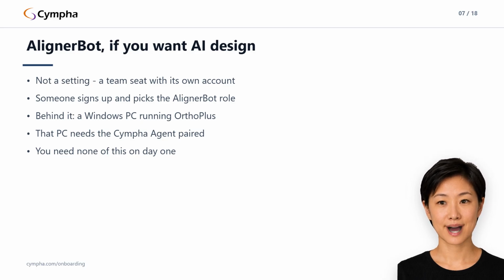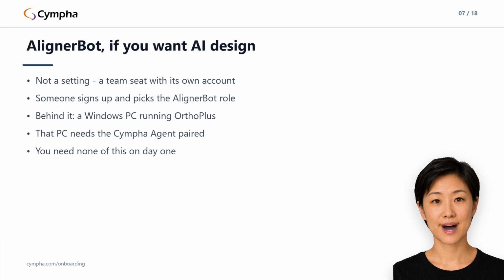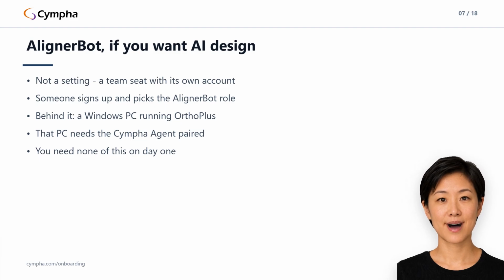Before we get to assigning work, the thing to set up if you want AI to design your aligners. Aligner bot is not a switch you turn on. It is a team seat with its own account that happens to be software. Somebody at your lab signs up with your manager email, picks the aligner bot role, and you approve it exactly like a designer.